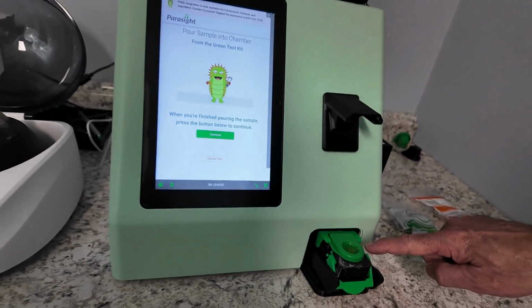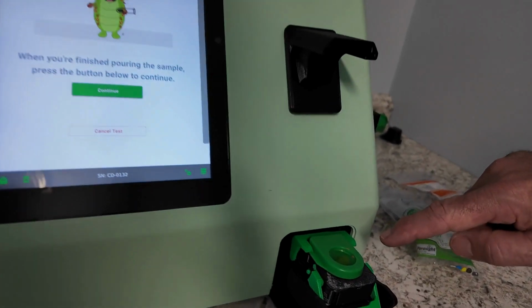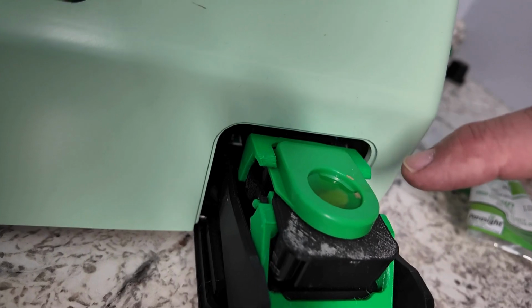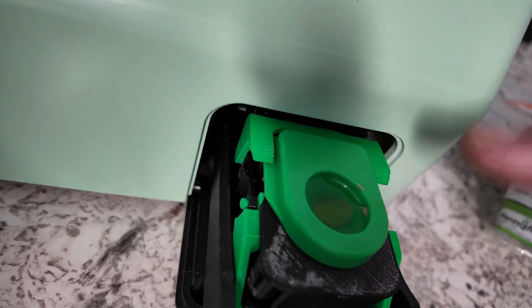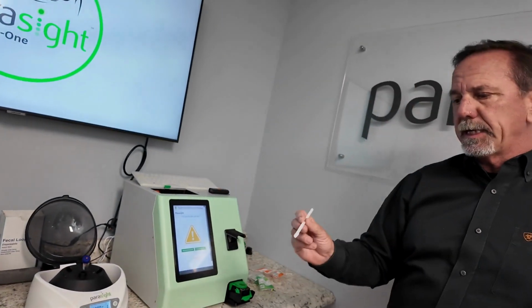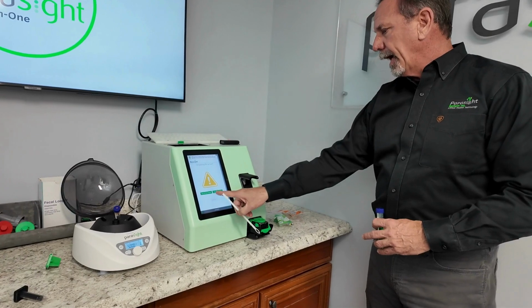So you'll notice that the level of the fluid here is not being sucked down to expose the bottom of the specimen chamber, the net there. So you can hear that the unit is trying to suck that through, but it is not sucking through the liquid. The first thing you can do to try to unclog it is to take something a little bit blunt and stir that egg chamber as it is working.